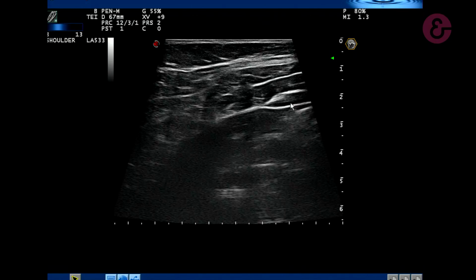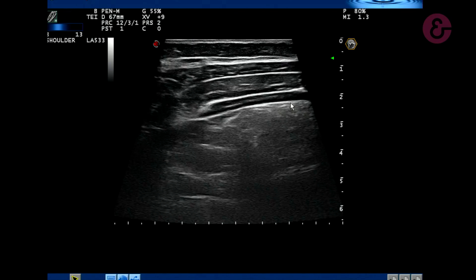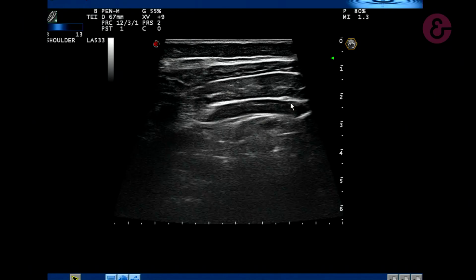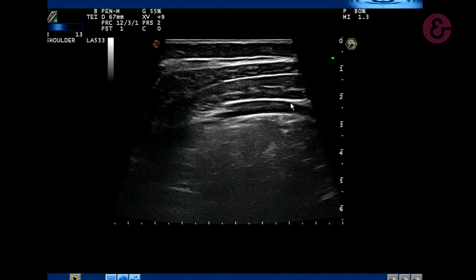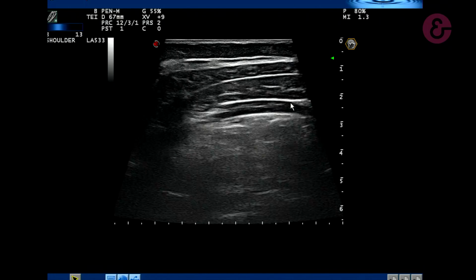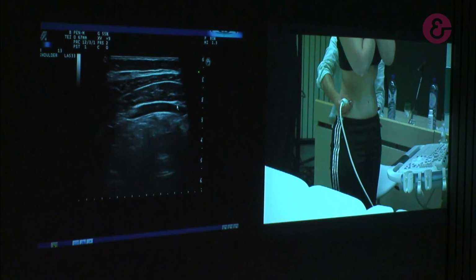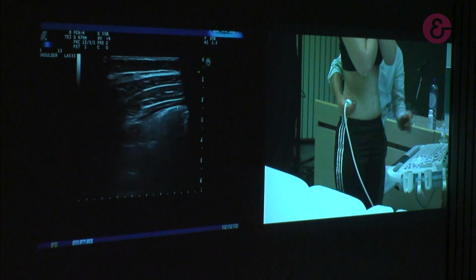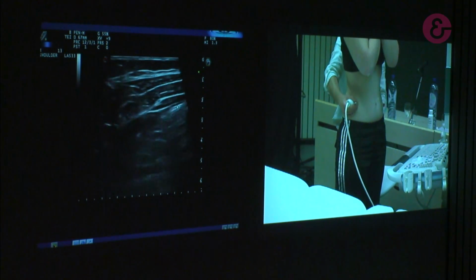Again, breathe in, breathe out. Very good. Keep this contraction and start. And come back. And relax. Okay, now we can try with just one leg, so a squat on one leg.